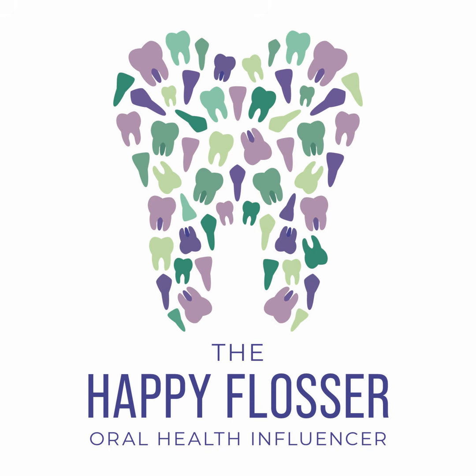If this is a patient of record that you've seen before, you can figure out if it was something that was there before. Sometimes having the previous radiographs goes a long way at helping you figure out the severity and seriousness of this. But the borders tell us a lot as well. When you have a well-defined narrow zone of transition, very slow growing margins, those margins tell us it's usually benign. It's corticated, it's regular and smooth.